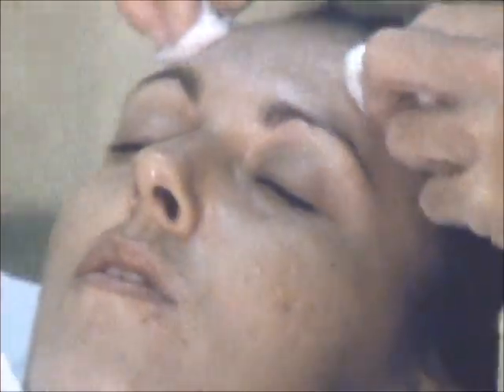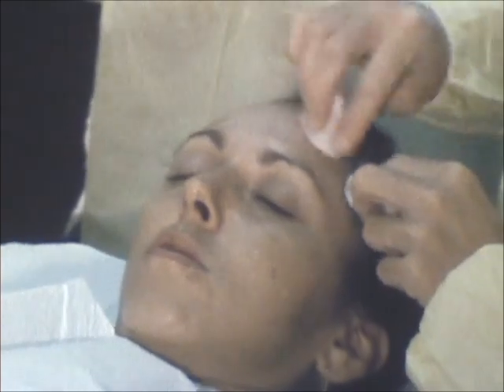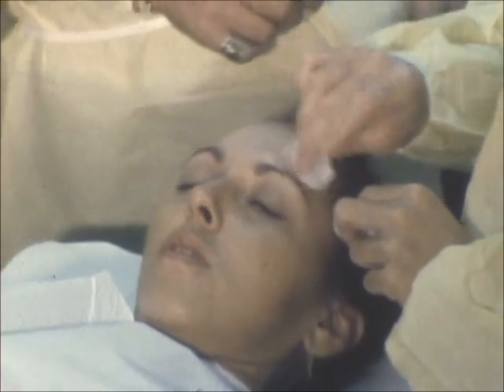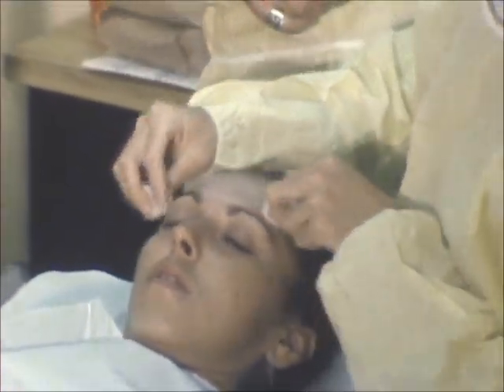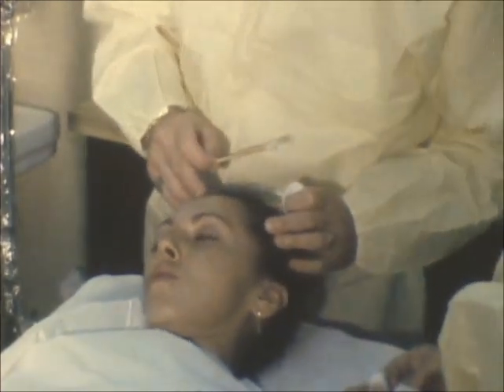Okay, let's neutralize that. Just keep your eyes closed now.